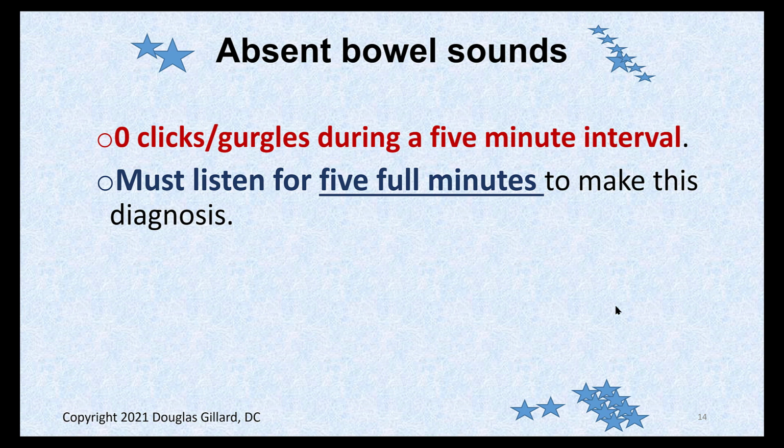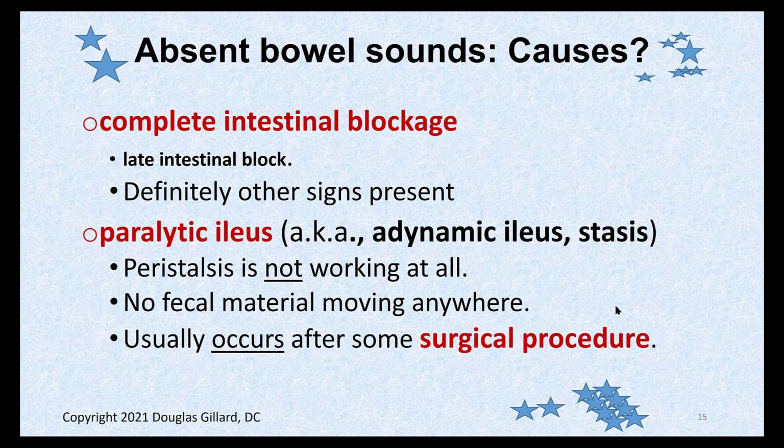Absent bowel sounds are not good. And the patient has to be sick for this. You have to listen for 5 full minutes. And if you don't hear a single click or gurgle in someone who's sick, they go right to the ER. That's a problem, especially if they have other symptoms, stomach pain, fever, and such. Absent bowel sounds indicate a complete intestinal blockage, and it's usually a late blockage.